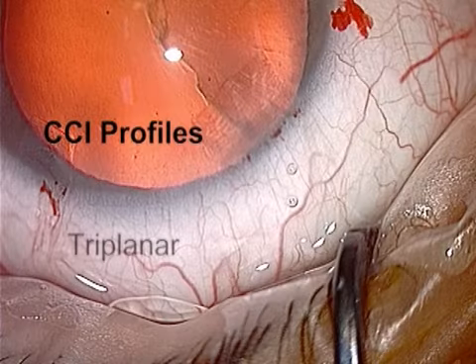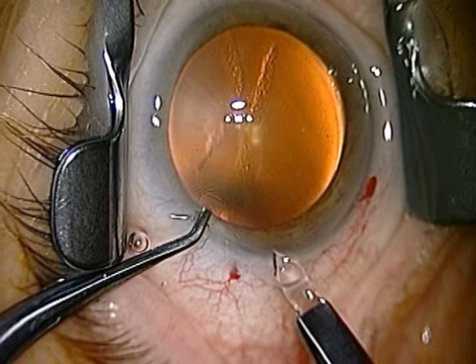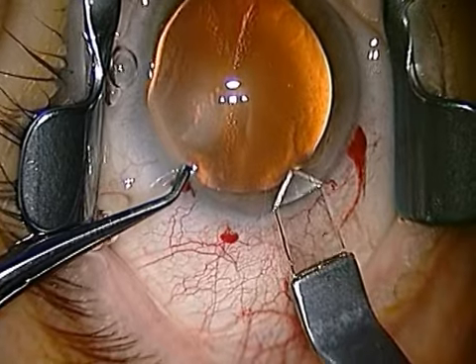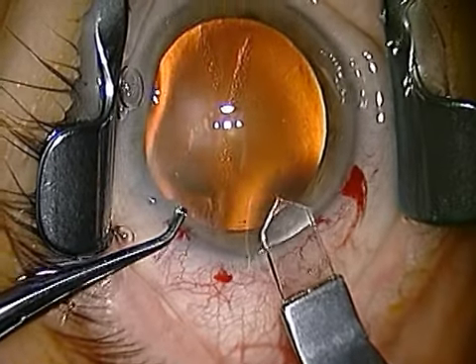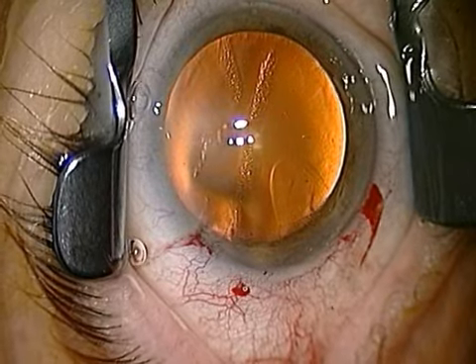The architecture of the triplanar or three-step clear corneal incision was originally designed in an attempt to guarantee a self-sealing and completely secure wound. Practically speaking, it's difficult to be convinced that it's any more stable or watertight than a simpler two-step incision. The distinction is probably not one of any great practical significance.